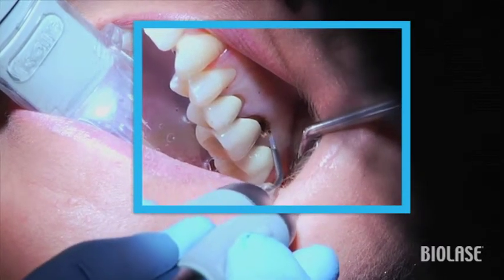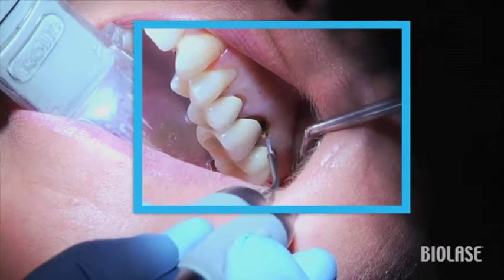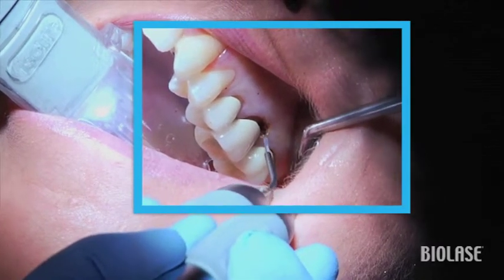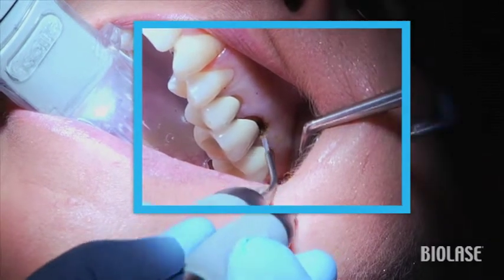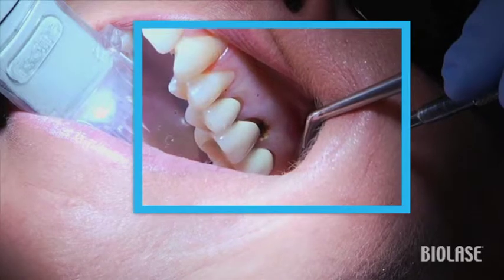Initiate the tip and hold the tip perpendicular to the tissue and root. Lightly contact the tissue and follow the contour of the tissue using a crescent-shaped motion to expose the decay under the tissue.